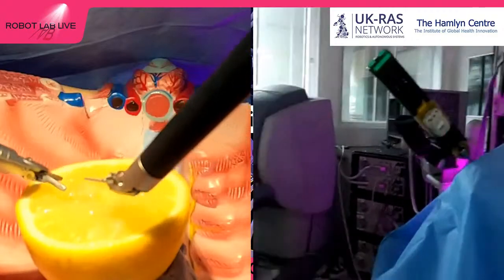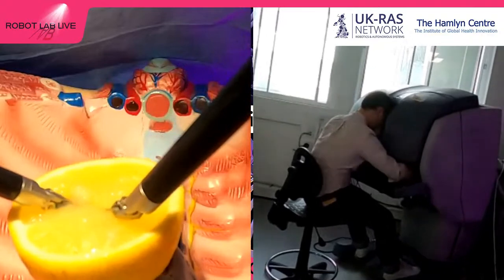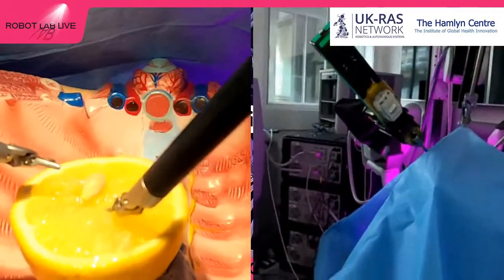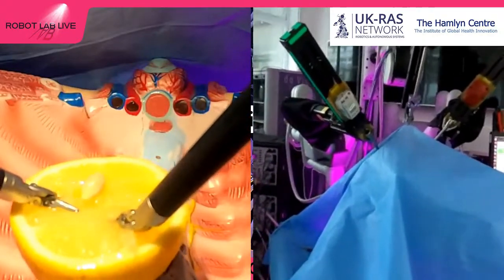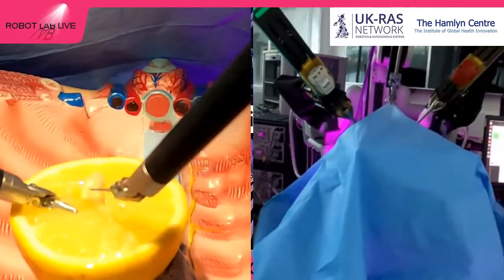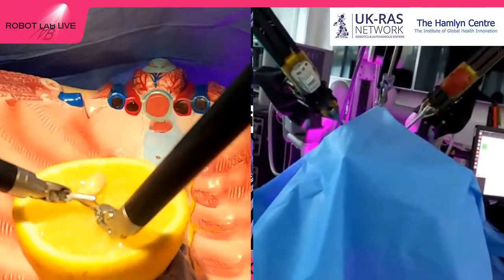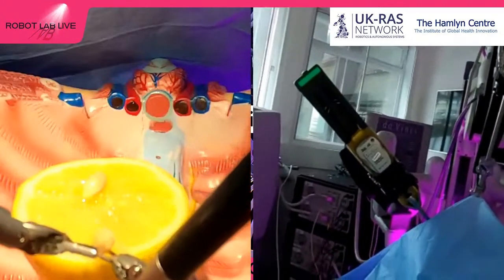But yeah, Sen knows what his target is. He's in control of everything. But when we leave this robot to operate on its own, we have to somehow teach the robot where to go and where not to go. It's kind of like in a video game, if you think about it. You're playing in some parts of the map of your game, right? And you cannot go to other areas of the map, right?